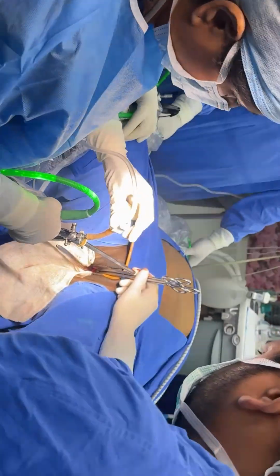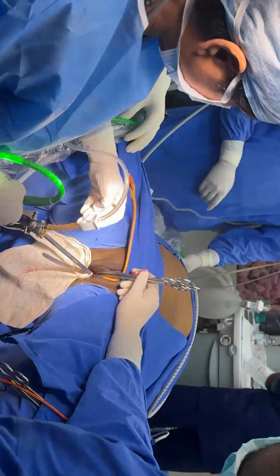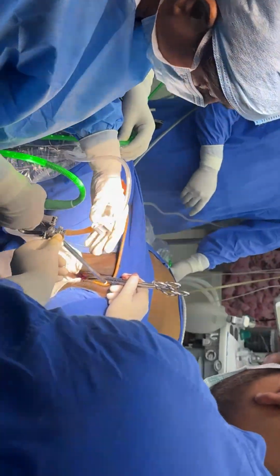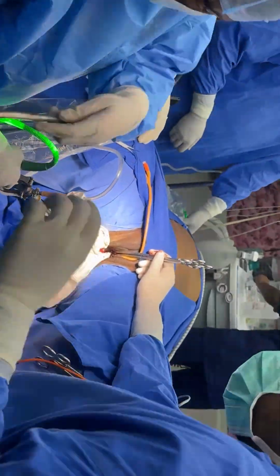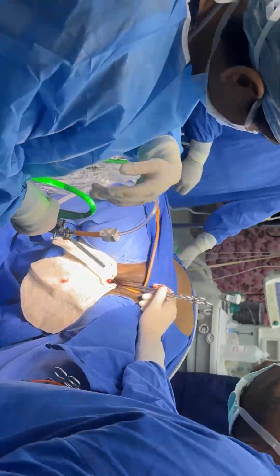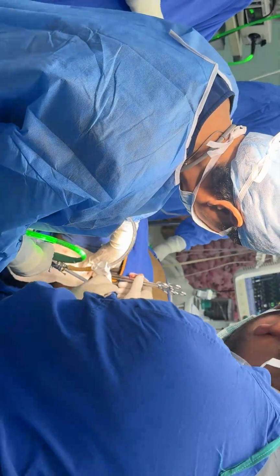So I'm using a double barrel resectoscope, 26 French, and I'm still using a monopolar. Many of you might ask, but since safety is one thing, bipolars are designed for that.